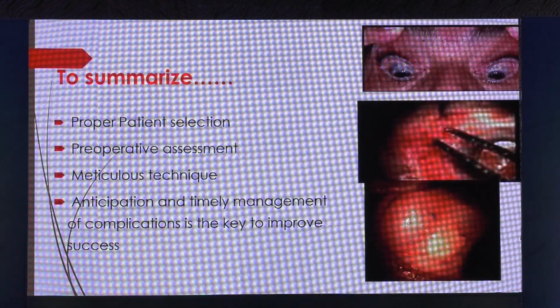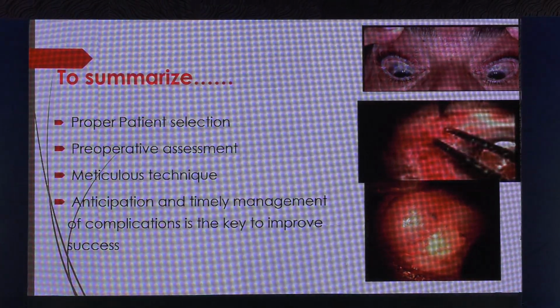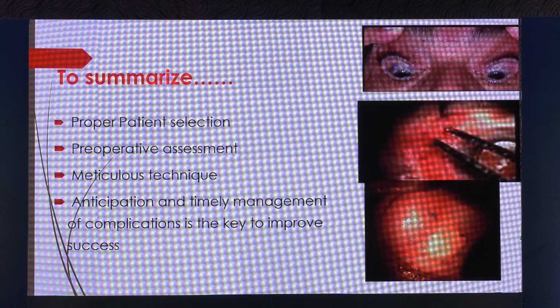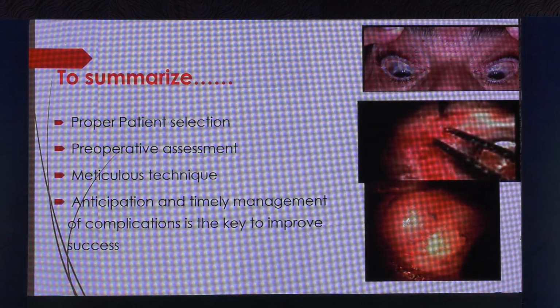So to summarize, proper patient selection, a very good preoperative assessment, looking for the extent of the PAS and the lens status, meticulous technique, some modifications of the technique on the table, and anticipation and timely management of complications is the key to improve success of AGVs.